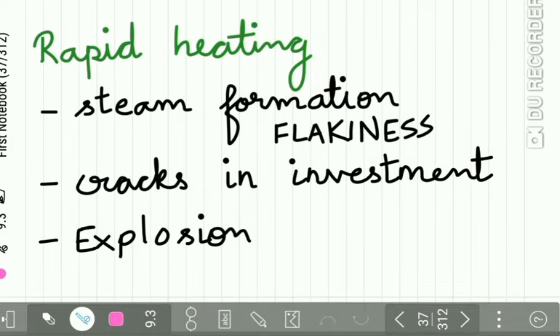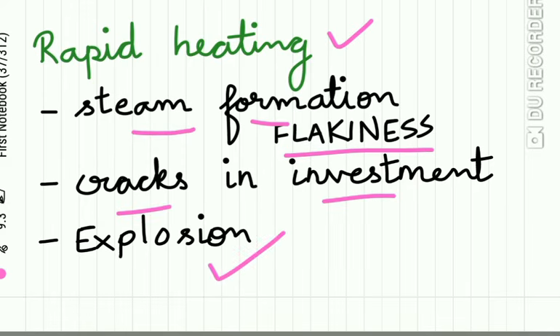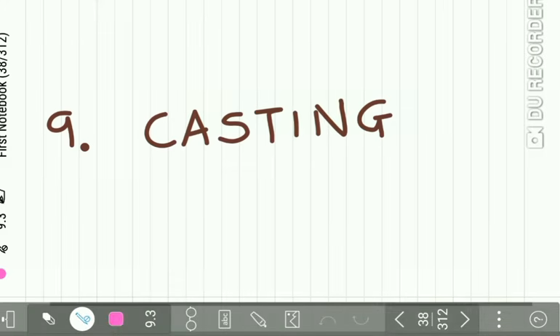If this heating is carried out very rapidly, there may be steam formation in the mold causing flakiness of the mold walls. And cracks may also occur in the investment, and in extreme cases, explosion may occur.